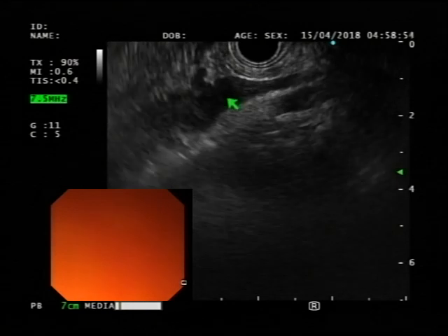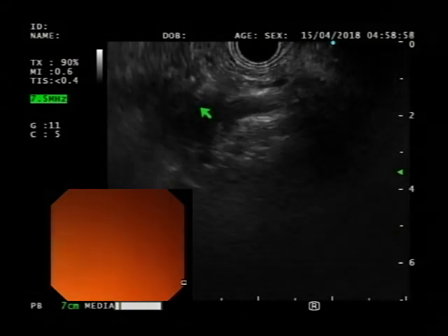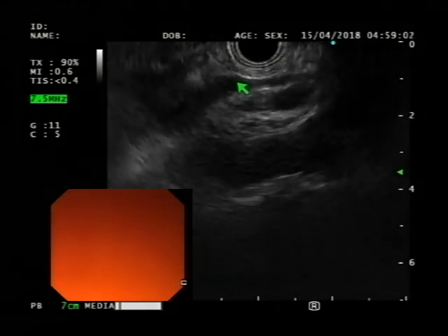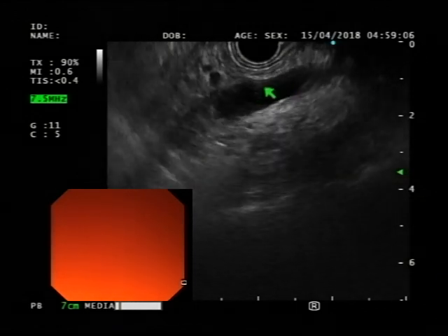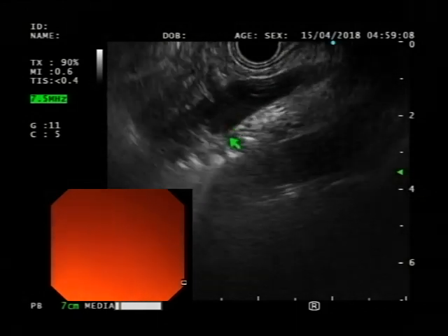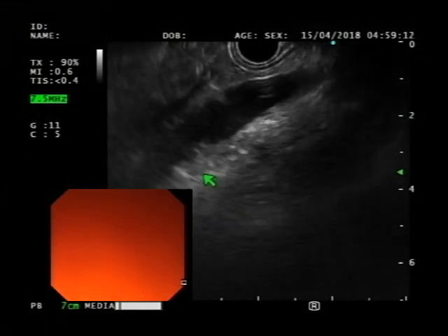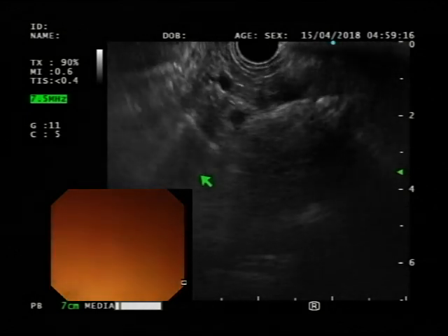This is that view that you were saying. So now you have the splenic vein going in. So there you go. You can advance a bit because it's away from you. So advance a tiny bit. There. Okay. Splenic vein going into the portal vein that'll go down towards the liver. And then you may see the bile duct below here too. So advance a tiny bit and spin over that area.